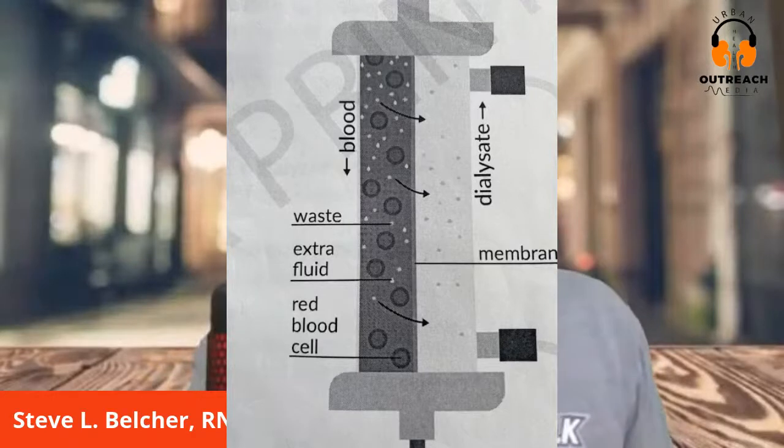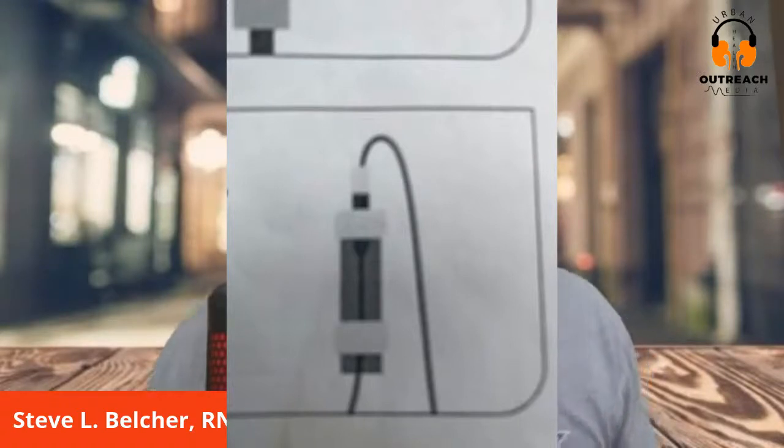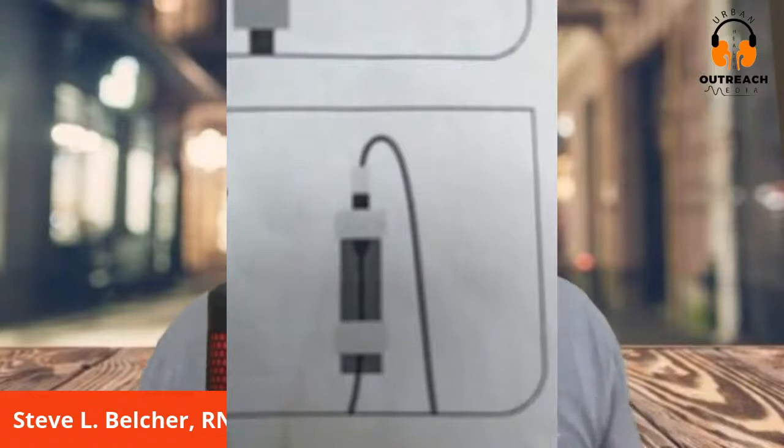Okay. Now, as we take it on home, the dialysis machine keeps you safe. Now, this is where the venous trap monitors air, if air gets into your line. If air gets into the blood tubing, it could be harmful to you. Luckily, the dialysis machine has 2 air traps. One is before the dialyzer and one is after. If an air bubble somehow gets through the traps, an air sensor will shut down the pump, an alarm will sound. Blood flow is stopped. I repeat, blood flow is stopped until the air is removed.